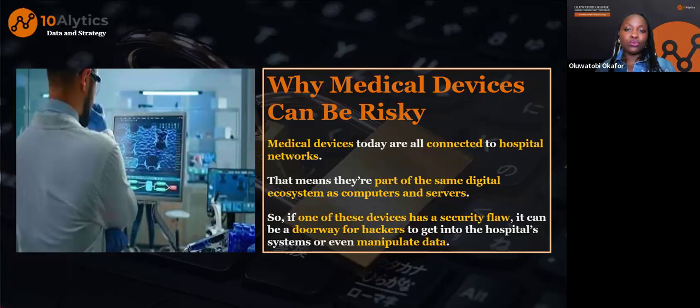But all of these tools are connected to something. When they are checking the heart rate on the heart monitor, this tool is connected to the network because it has to transmit data to either the nurse's station or the doctor that is caring for the patient, I believe.